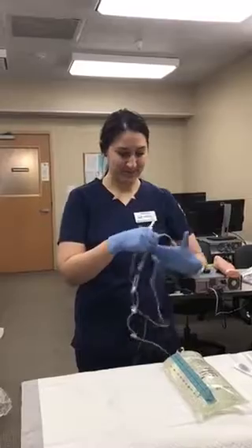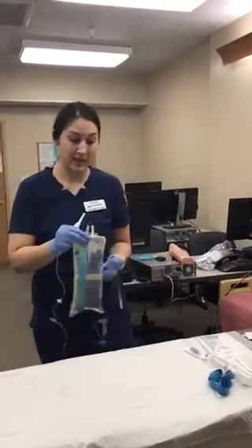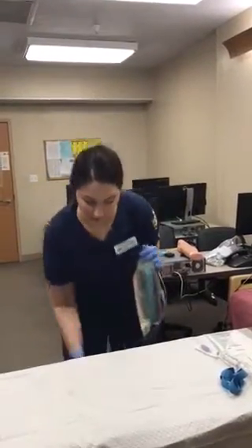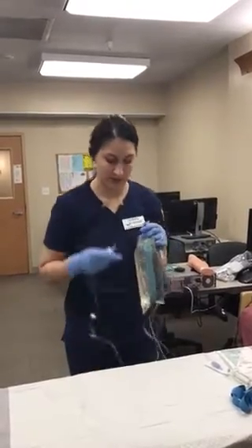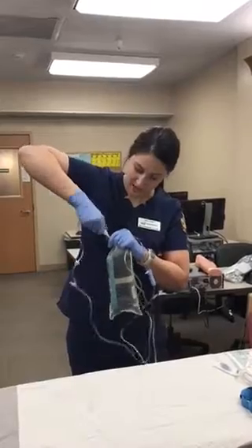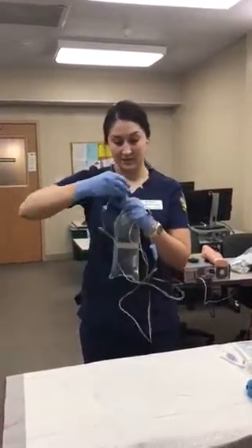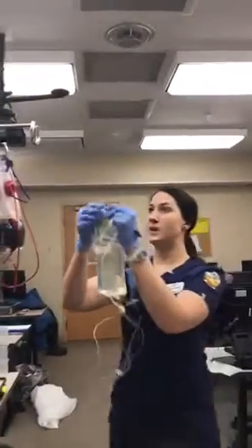All right. So I'm going to take my bag, and maintaining sterility the whole time, I'm going to go ahead and pop off the tube for that, and then pop off the cover for my spike. I'm going to get that in there. You want to make sure this is in here nice and snug, otherwise you're going to have a mess. I'm going to flip that bag, and I'm going to hang it up.